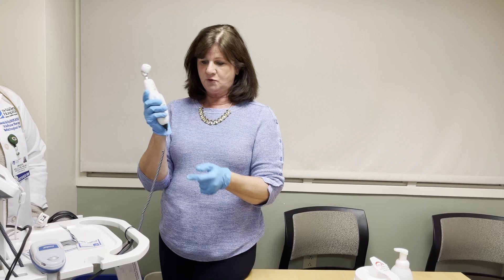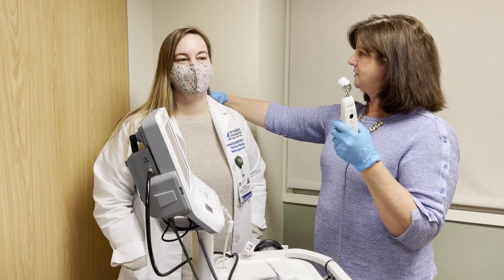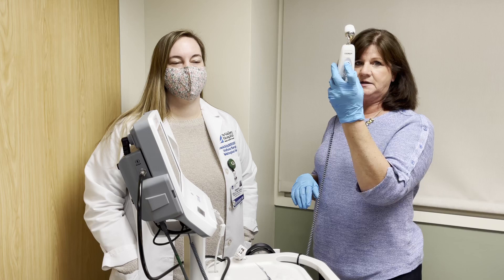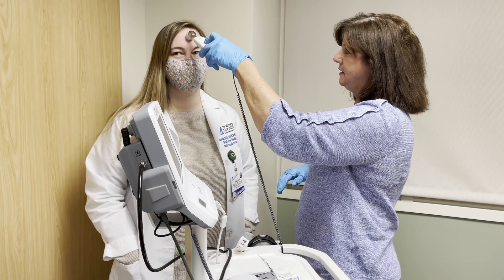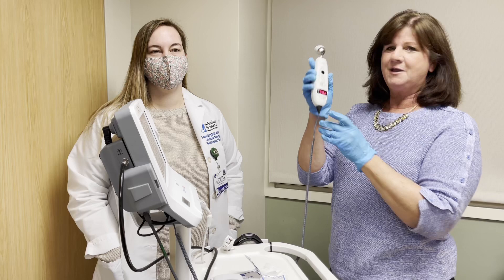So we're going to brush away any hair that's on the forehead and anything behind the ear. You're going to depress the button and start right in the center, go across to her hairline, keep the button depressed, and go behind her ear. Now you're releasing the button, and we're at 99.2.